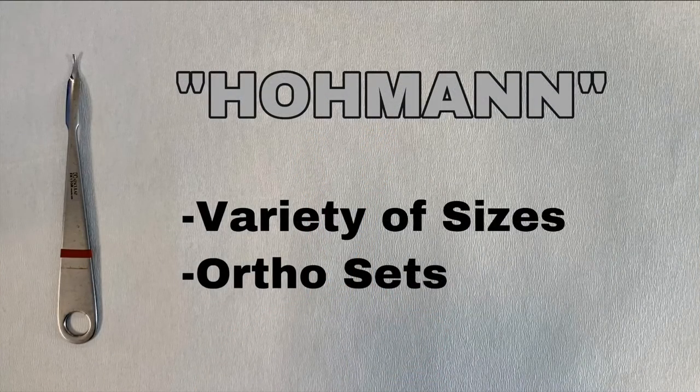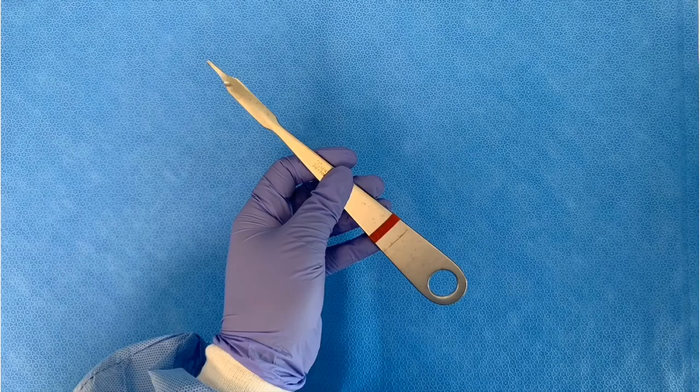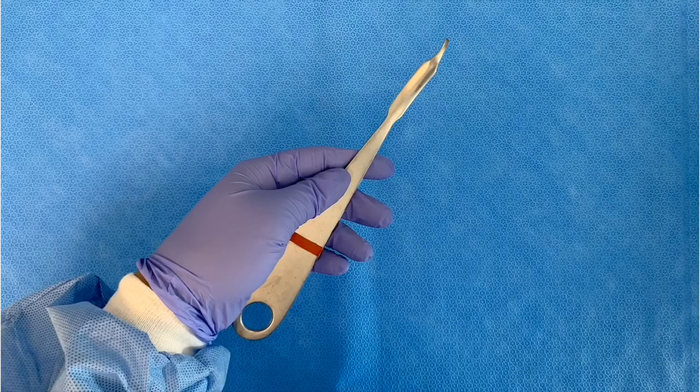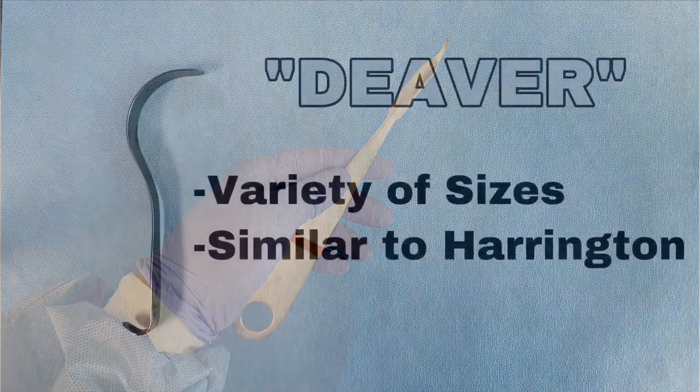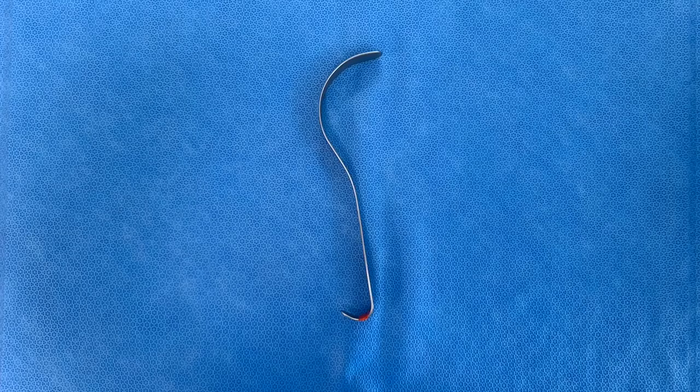This is the Hohmann retractor. It comes in a variety of sizes, usually comes in pairs, and is usually found inside ortho sets. This is the Deaver retractor. It comes in a variety of sizes and is similar to the Harrington retractor.